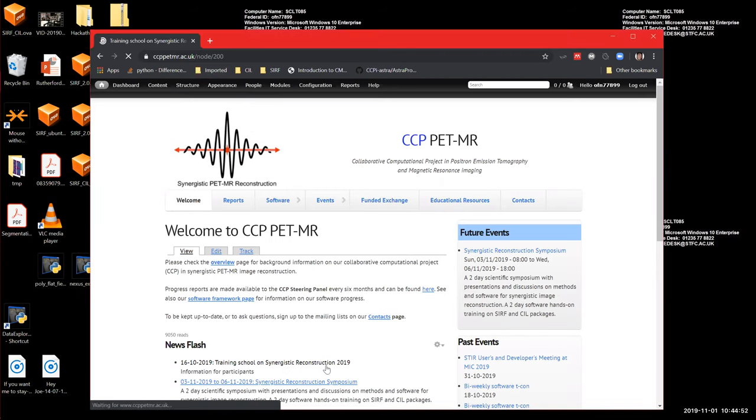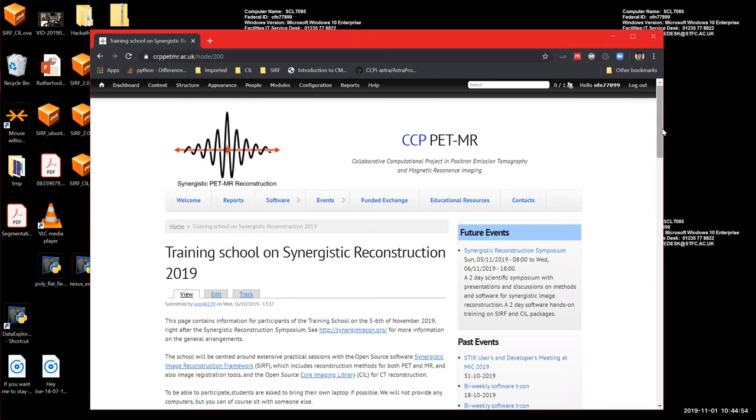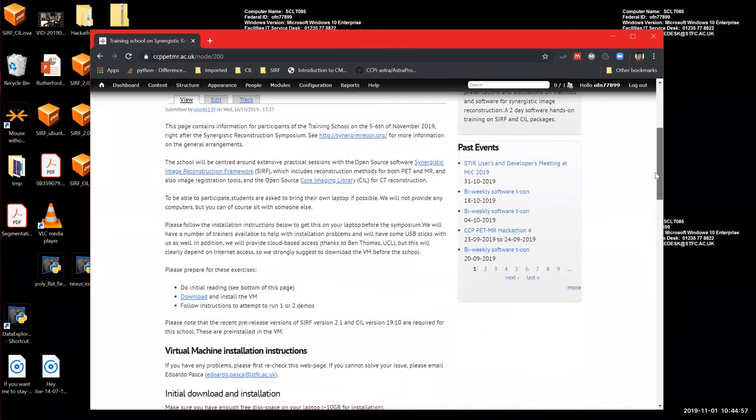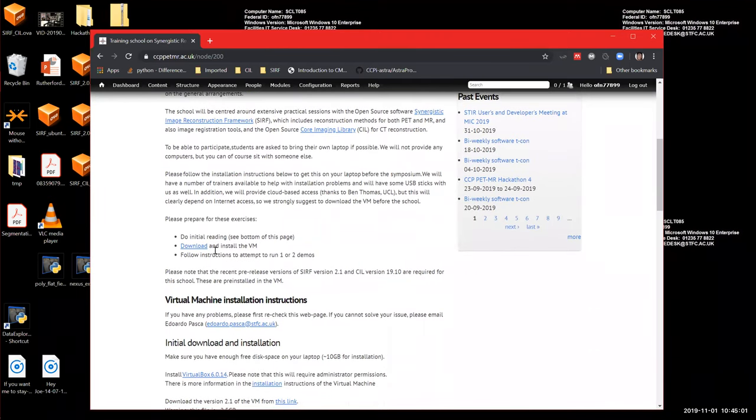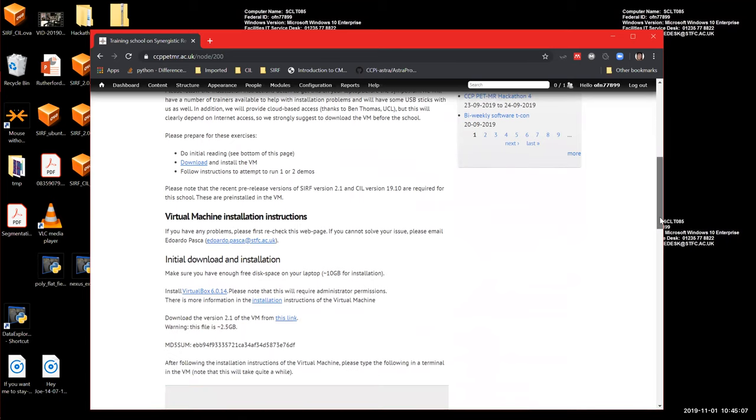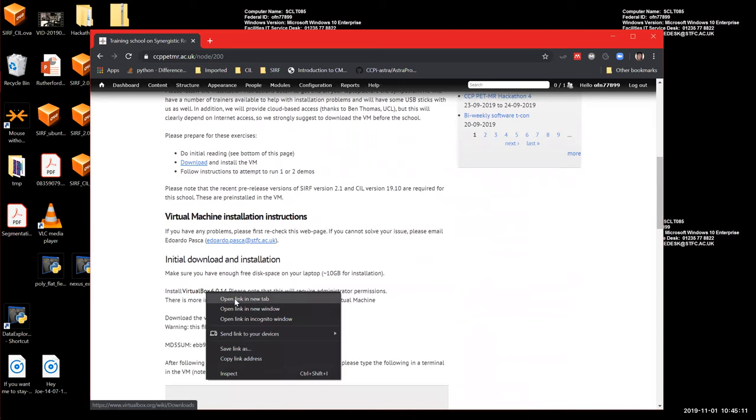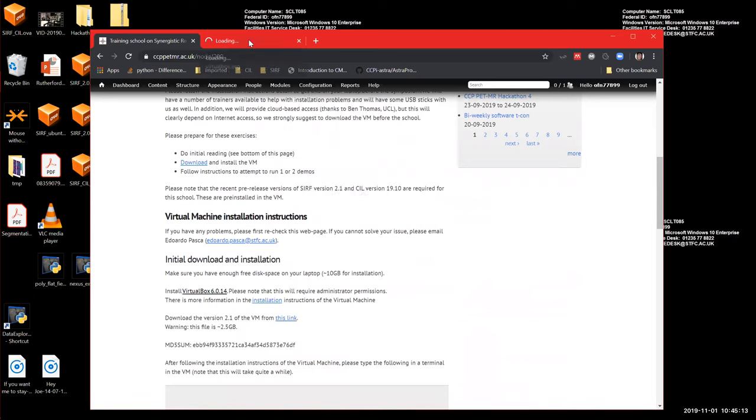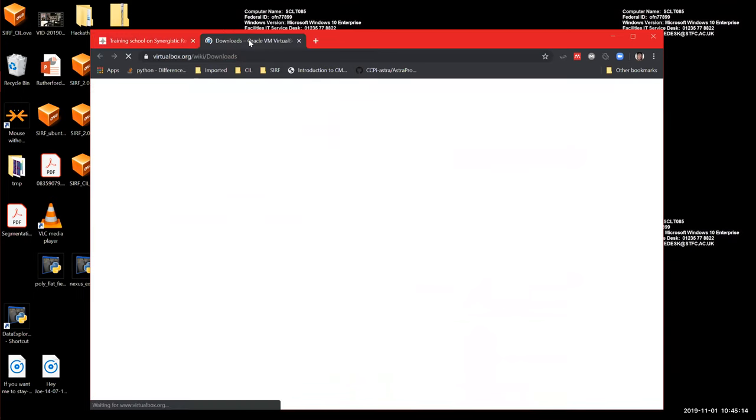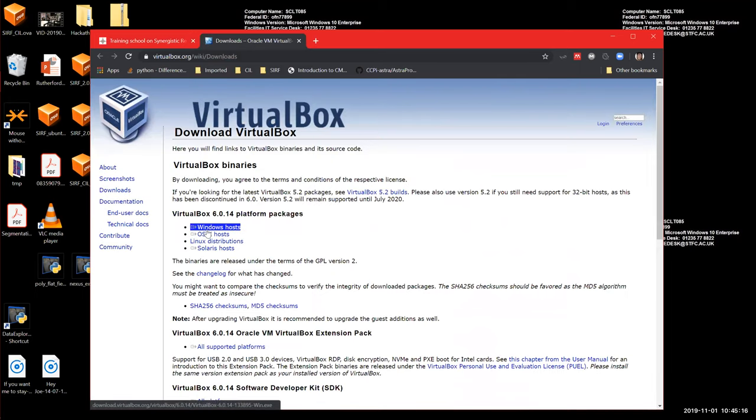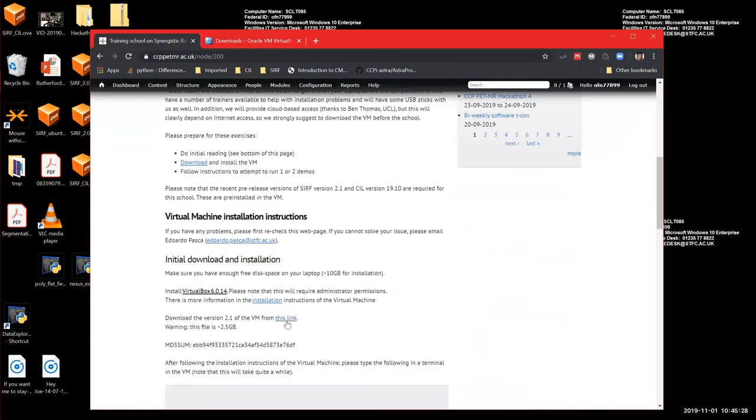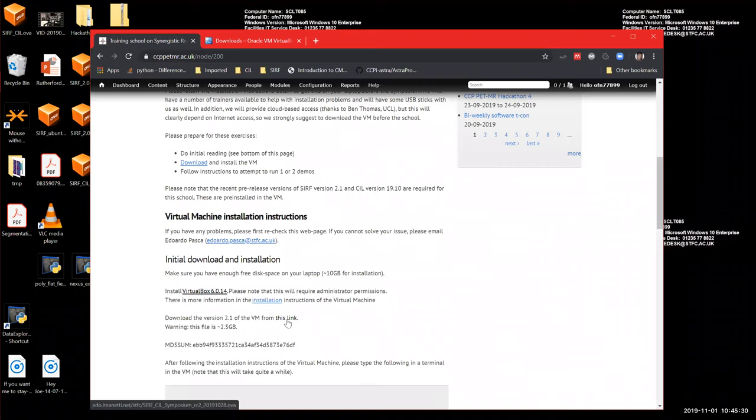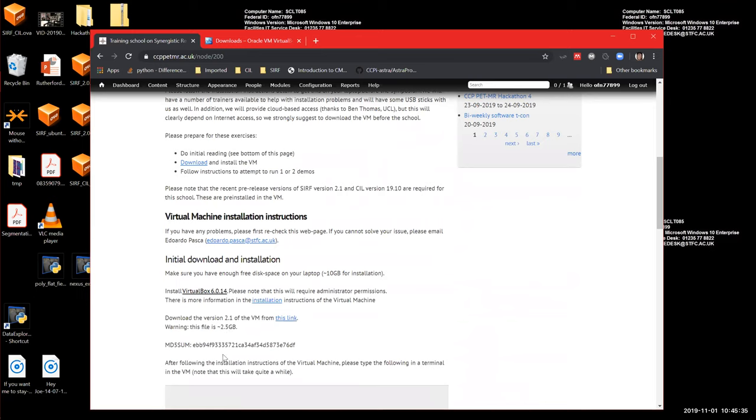You click there and you are redirected to this page. You will see some instructions and it says do initial reading, download and install the VM. So how to do that, other than sending me emails, is by installing VirtualBox. So you go to this webpage. You choose the host machine you want to install onto, so Windows or Linux or OSX. You install it. And then you download the file at this link. It should be about two to three gigabytes, so it takes a while. And this is the MD5 sum, so check that if you want to be sure that the data that you got are correct.